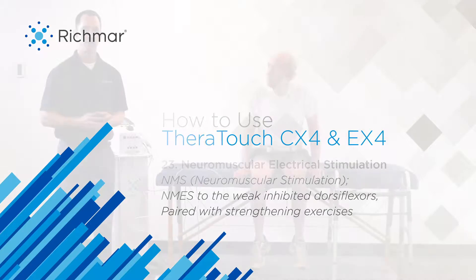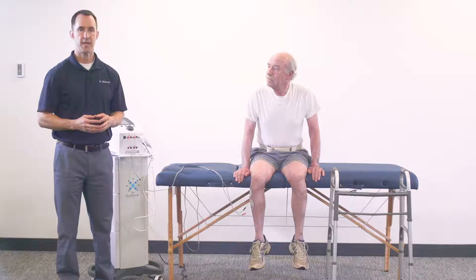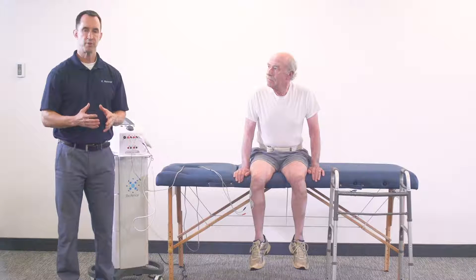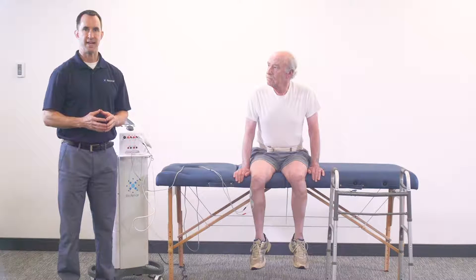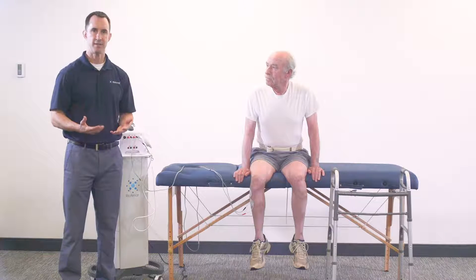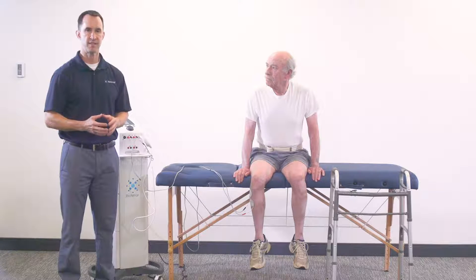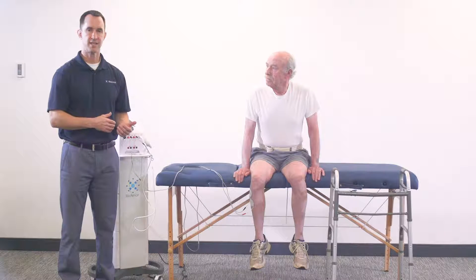In this example, you can use one of two waveforms: the symmetrical biphasic or the NMS waveform, which stands for neuromuscular stimulation. The treatment approach is using NMES to the weak-inhibited dorsiflexors of the ankle. The mechanism of action is to activate the weak-inhibited anterior tibialis muscle to restore active dorsiflexion. The clinical example is to facilitate the ankle dorsiflexors during strengthening exercises.